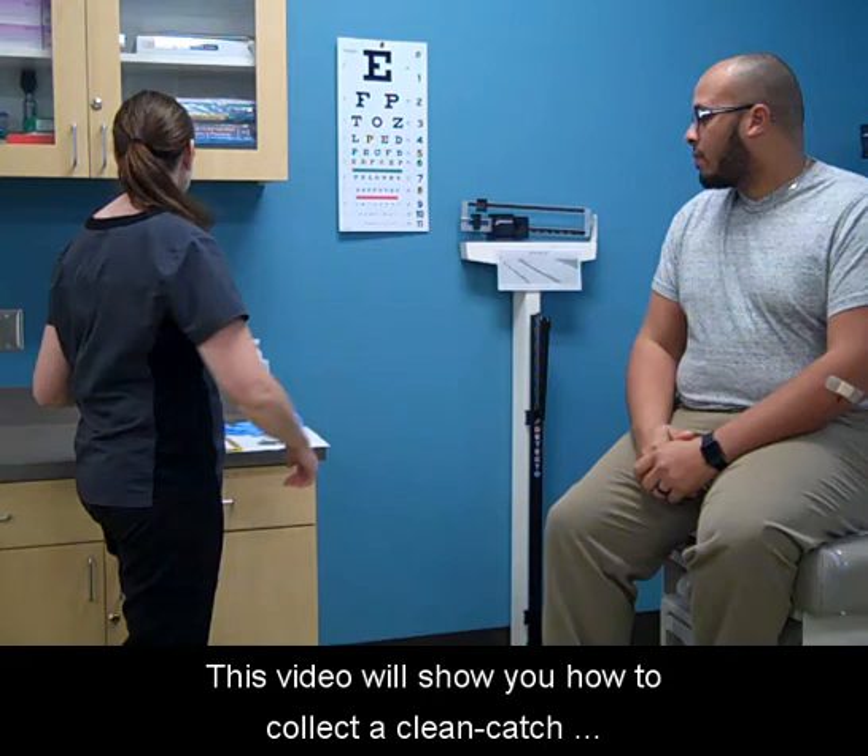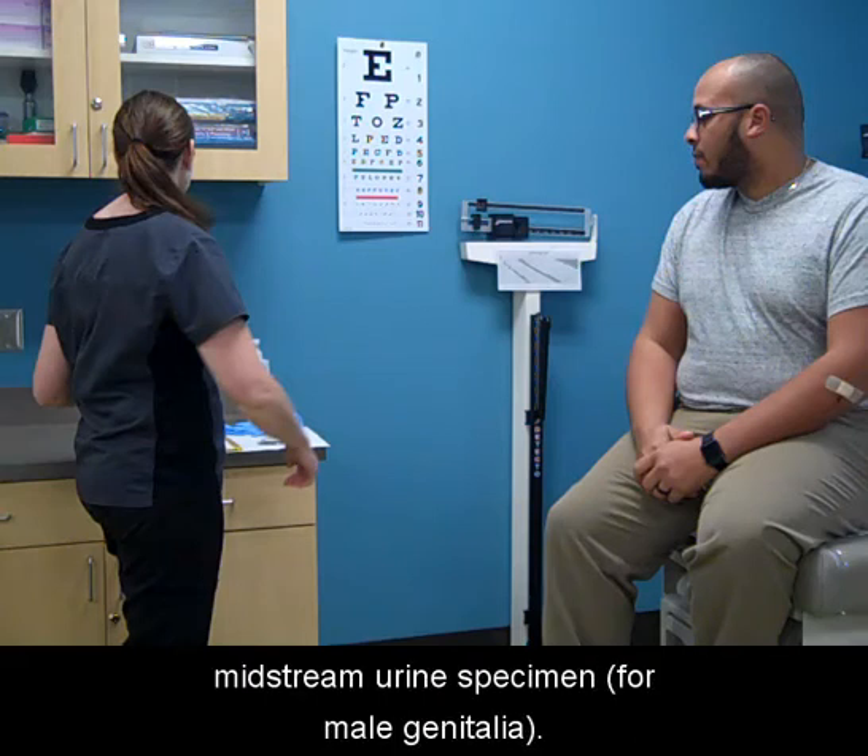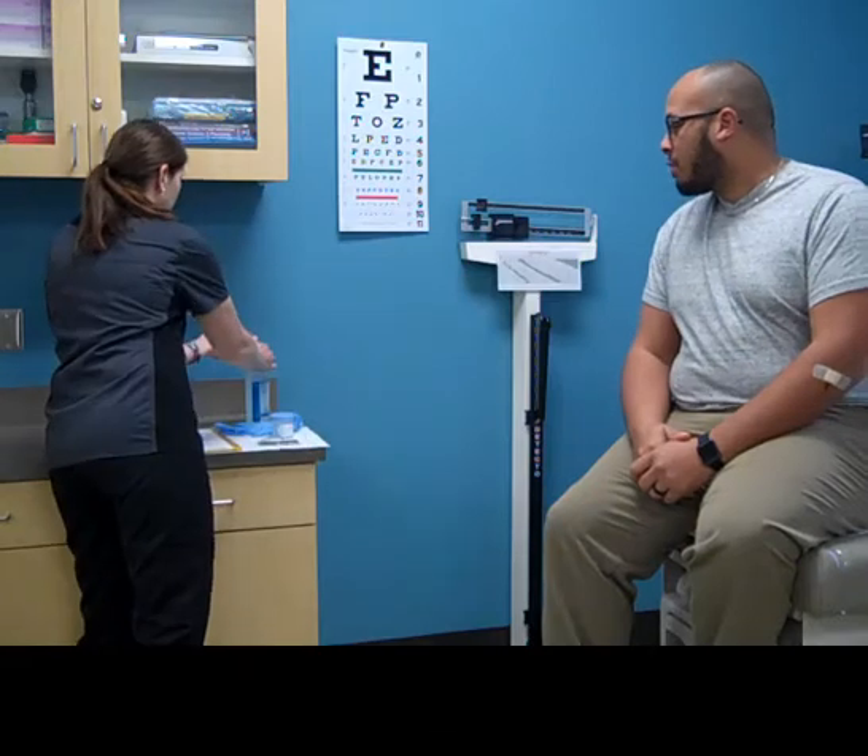This video will show you how to collect a clean-catch midstream urine specimen. Wash your hands.